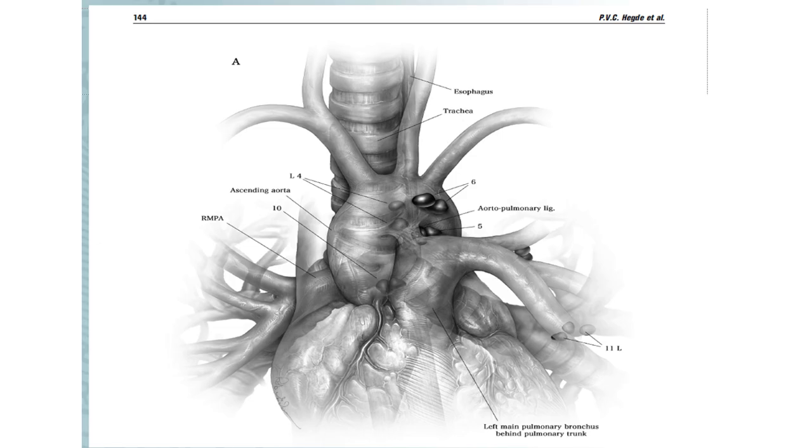This technique was actually described by my mentor, Moishe Liberman, a thoracic surgeon at the CHUM, University of Montreal, who published his first case series, I think in 2012, of 12 patients with this new technique, accessing the station 6 lymph node medial to the subclavian and getting into that para-aortic window without traversing the aorta. They got a diagnosis in all of them without any complications.